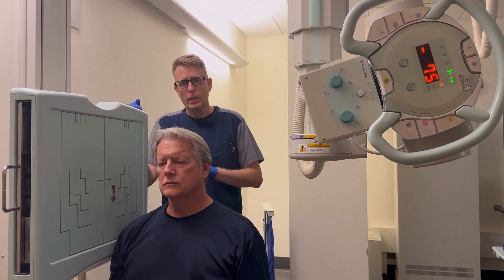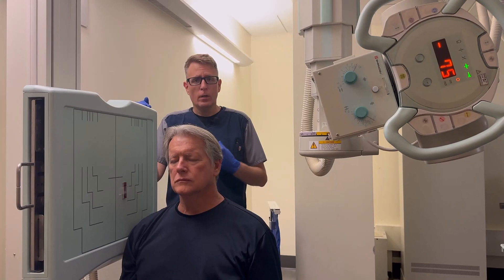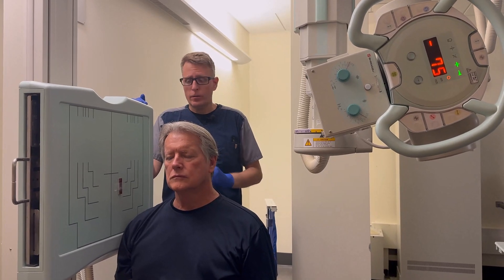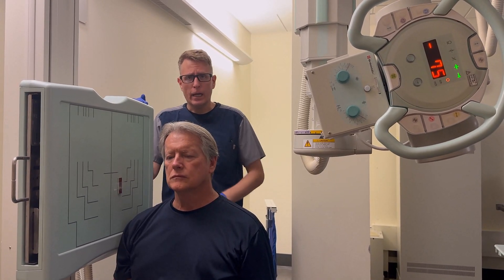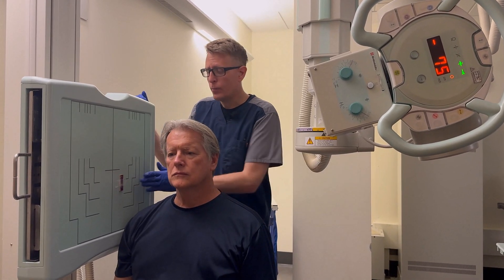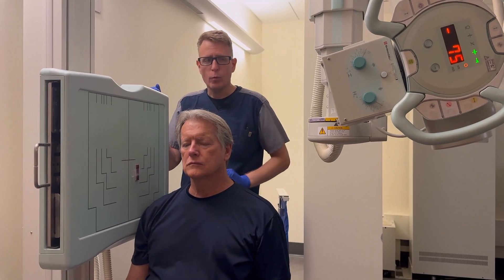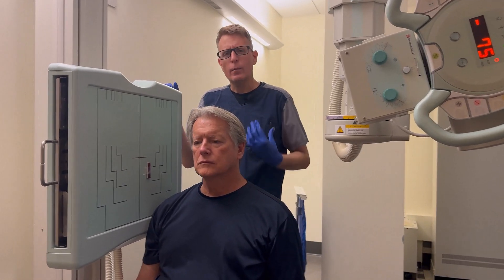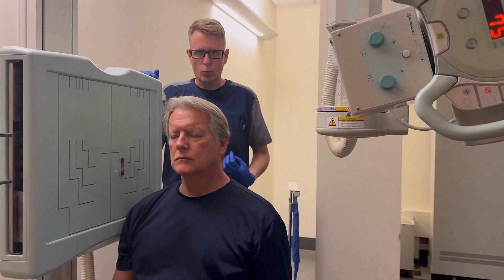We're going to do bilateral images, open and closed. Here I'm set up for a right lateral first, so I have my right marker already on the board, collimated down to about a three by three square.